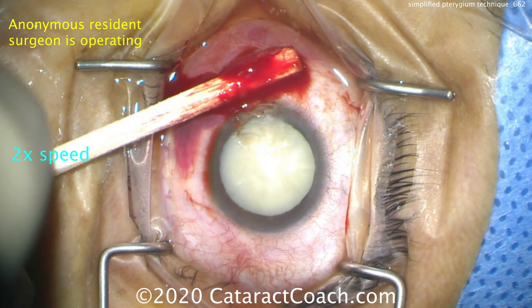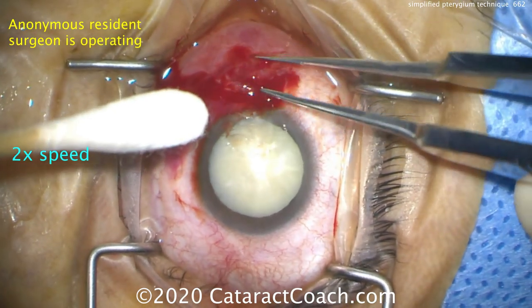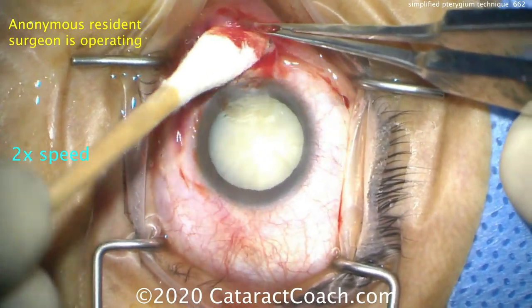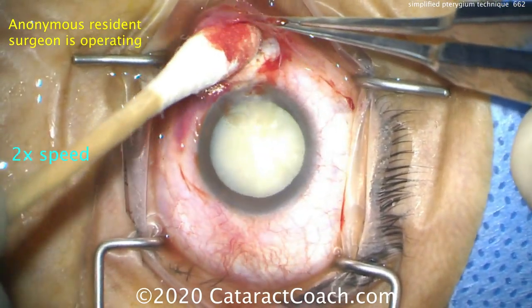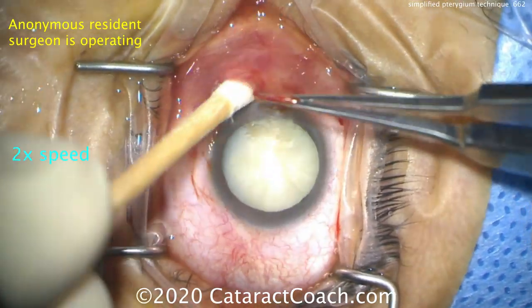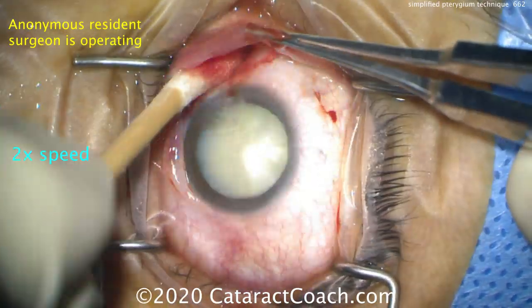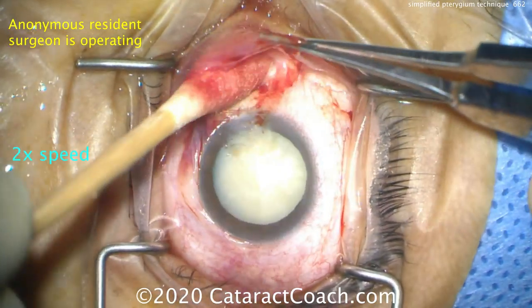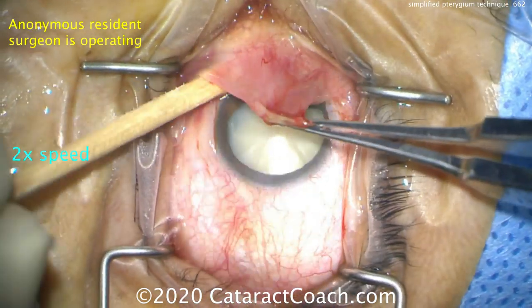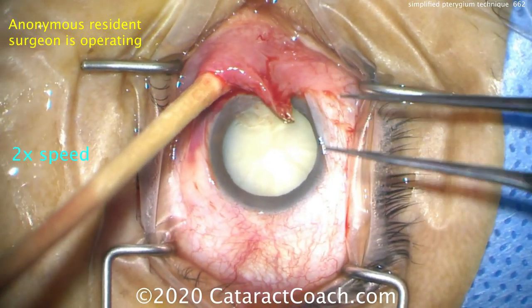Now we need to cut the pterygium off. We can use our same cotton tip and dissect back here. What's underneath there? The medial rectus muscle. Remember, spiral of Tillaux — 5.5 millimeters away from that limbus, you're going to find the attachment of the medial rectus. Don't damage that. So you can use blunt dissection with this Q-tip, getting it in deep to dissect it off — this cotton tip will not damage the medial rectus muscle.